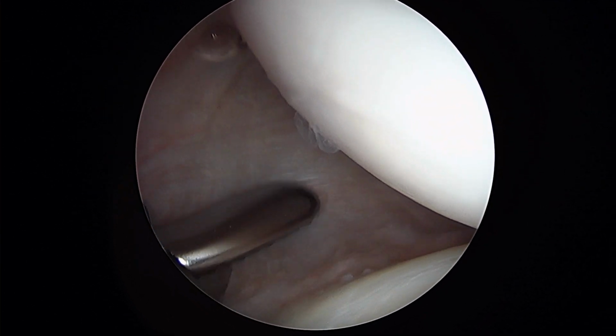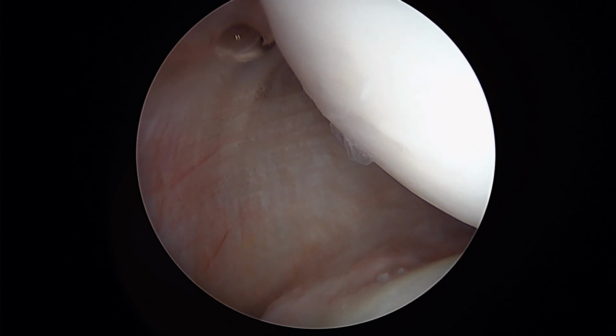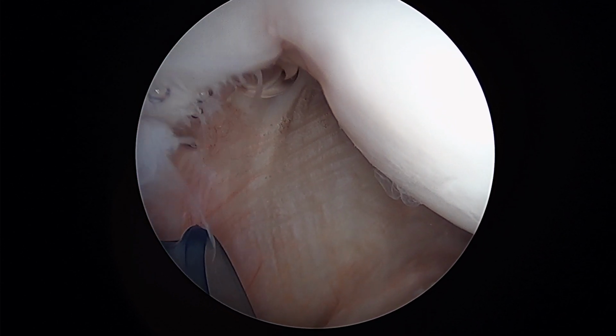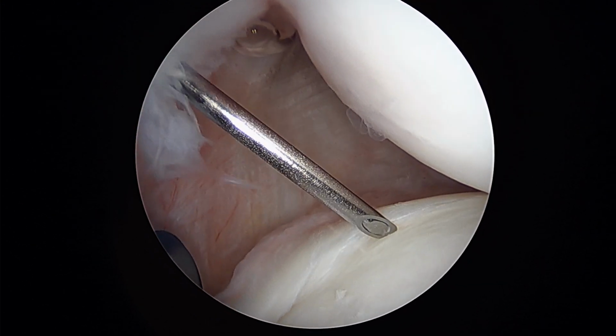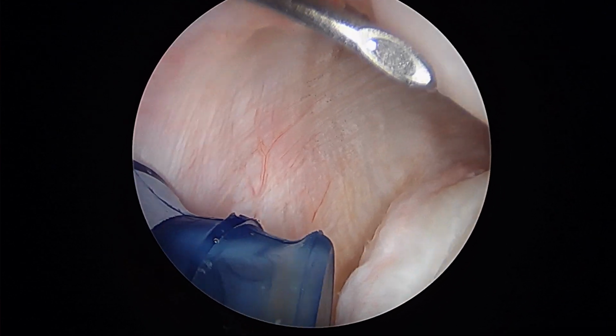Okay, so now we've roughened that up a little bit. We'll pull out the rasp, we'll take our spinal needle, and the anchor system that we're using allows us to pass these anchors in a percutaneous fashion. So, you know, we can place an anchor down something like that, and I like that position, so we'll get to work on doing that in just a minute.